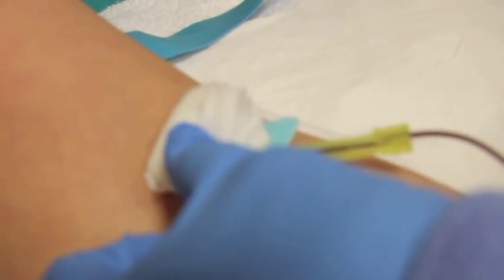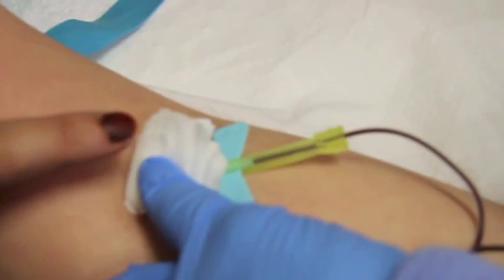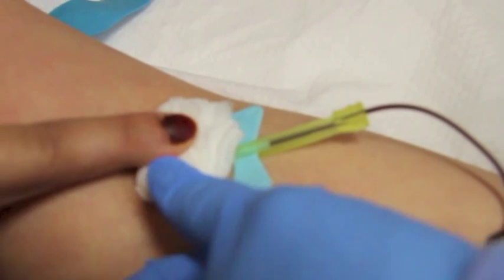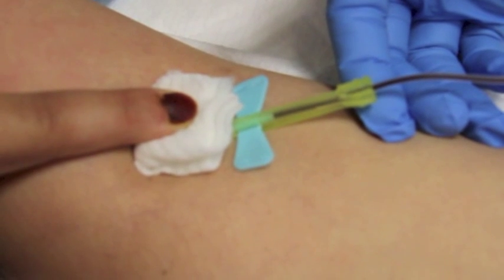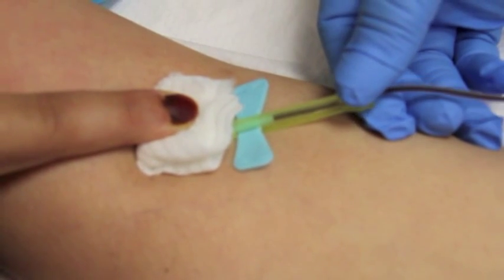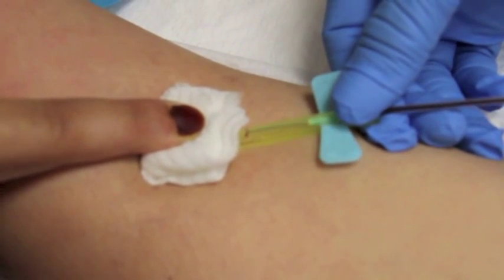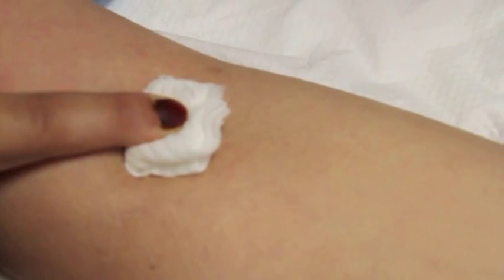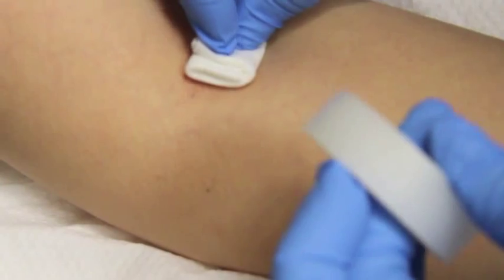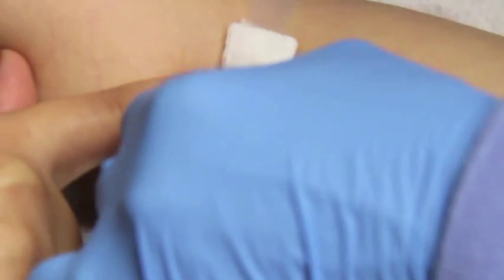A gauze pad is placed over the entry point of the needle and the phlebotomist then pulls the needle gently back out of the vein. As the needle is pulled out of the vein, it is retracted into a covering sheath that locks into place, preventing any further use of the needle. This is the safety feature of this needle. Once the oozing of blood has ceased, plaster is applied to keep the gauze in place.